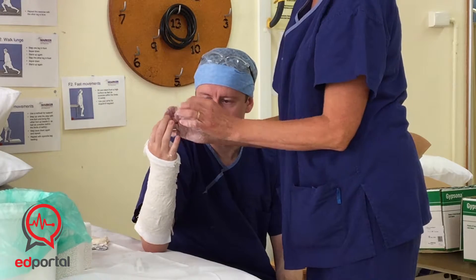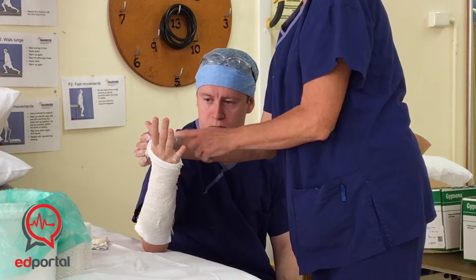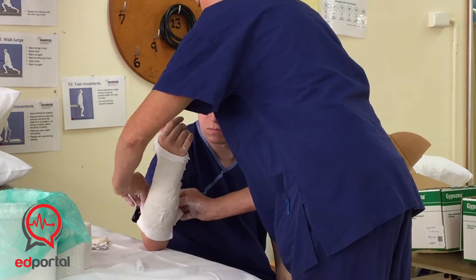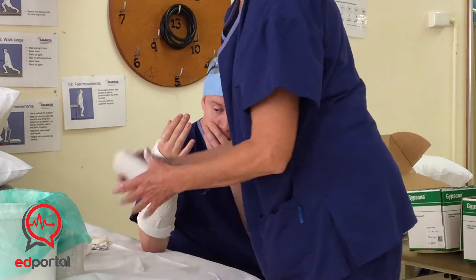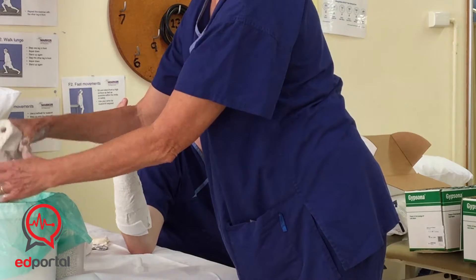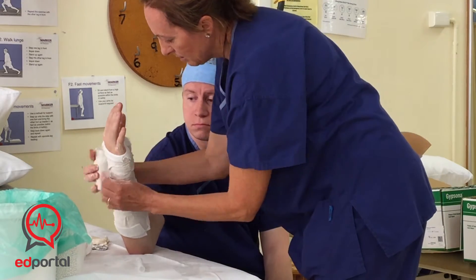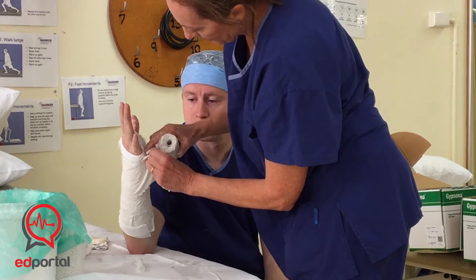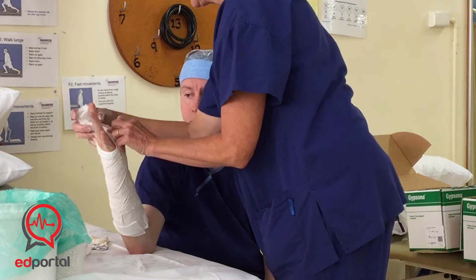We want plenty of room around the thumb — we often get casts cutting in on the thumb right up high. We don't need that unless it's a scaphoid cast. Keep the fingers mobile if we can. Then fold the bottom up. This next layer is a repeat — it's your tidy-up layer and gives it a bit more strength. Round at least twice and then up, but leave a little rim of the webbing so there's no plaster touching the skin.